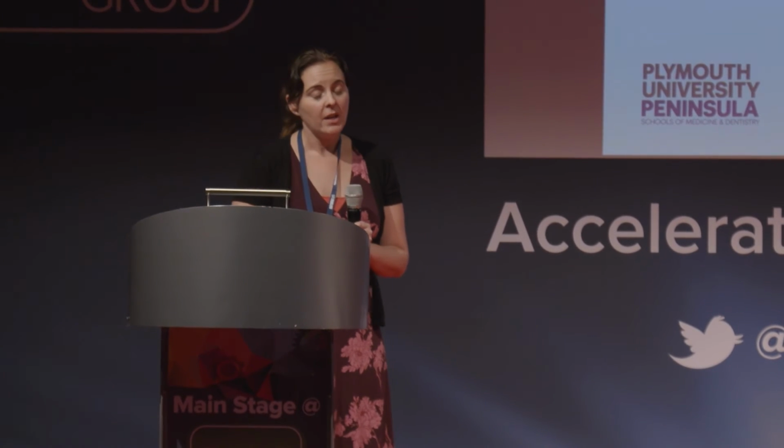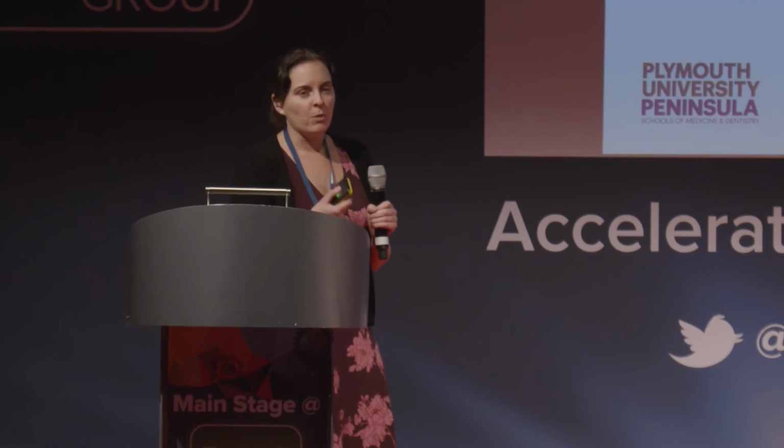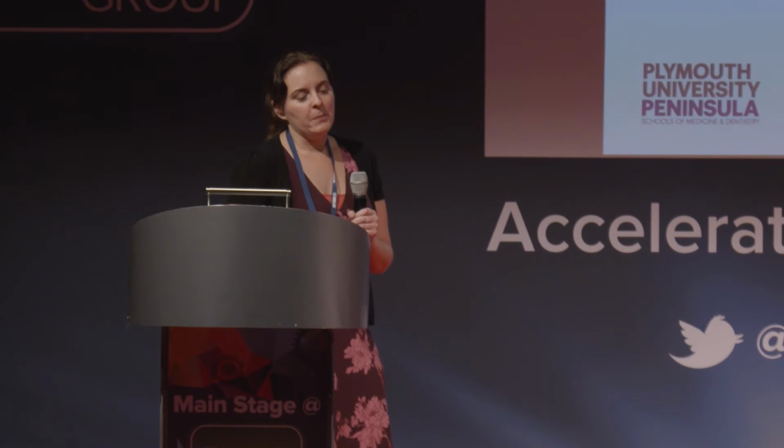We've made them so they're compatible with our current phantom head system, and we haven't had to invest in or design our own jaws to hold these teeth. And they're bespoke for our lesson plan, so we've designed the measurements to match what we want to teach. I've put at the end, they can be produced in smallish numbers at low cost.